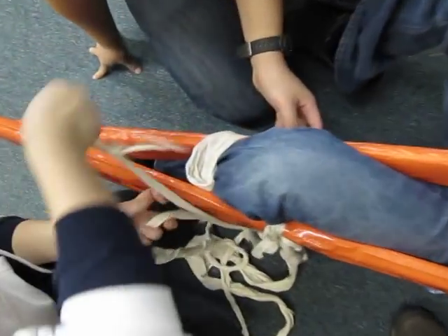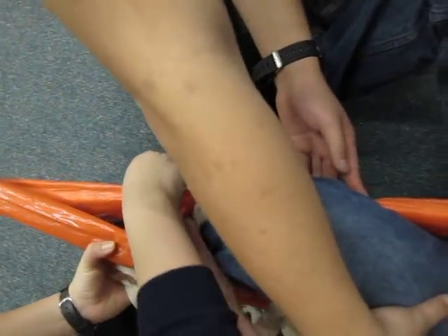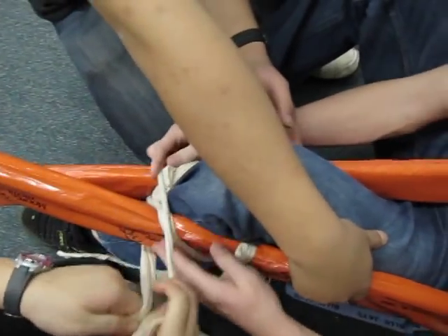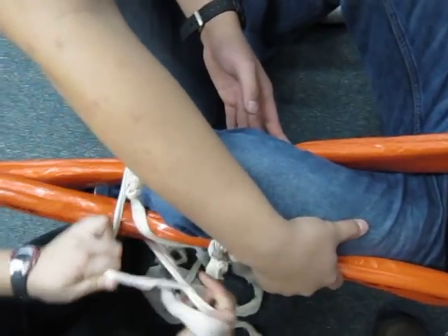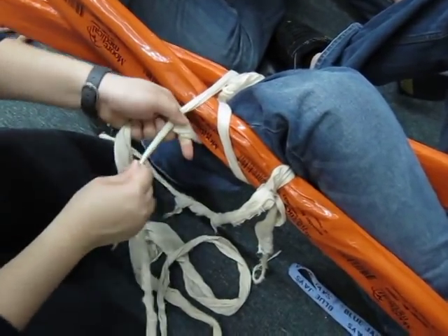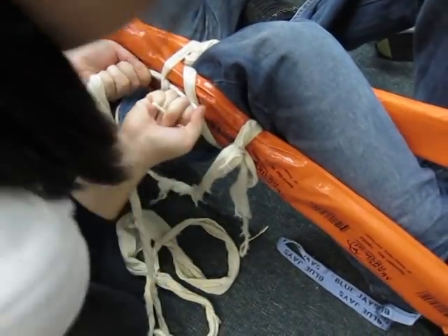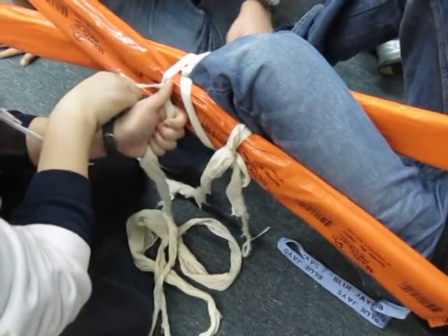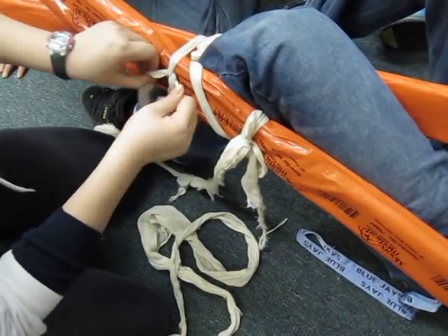You want to shimmy these up as close to the knee as possible. Oh, it's a figure eight? Yeah, it's a figure eight. You want to shimmy these up as close as you can. I'm trying to give you more slack for that one. I can work with this. Okay, so it's a figure eight and you want to shimmy as close to this part as you can. Does straight knee also have a figure eight? No, straight knee is not figure eight. Straight knee Tasia method is not figure eight.